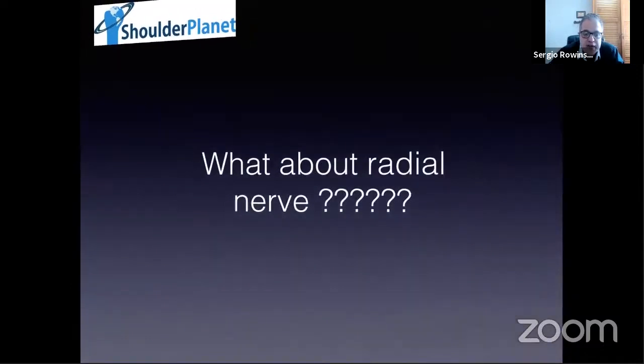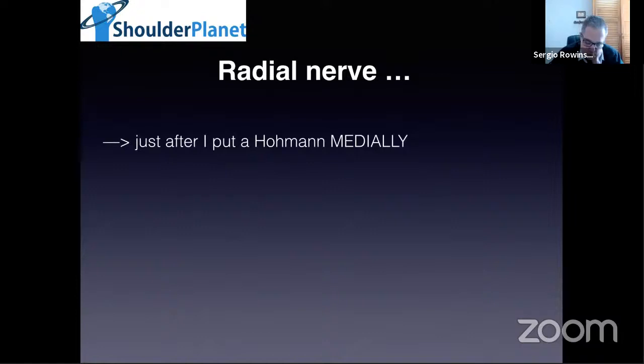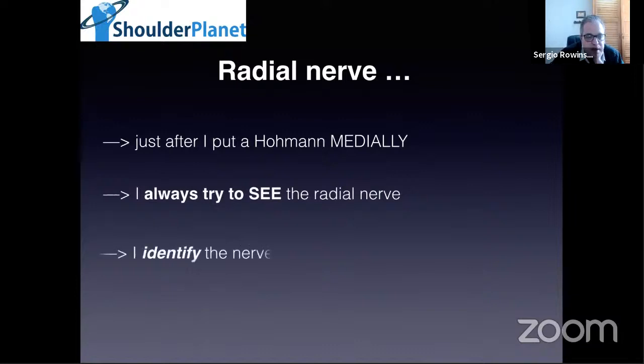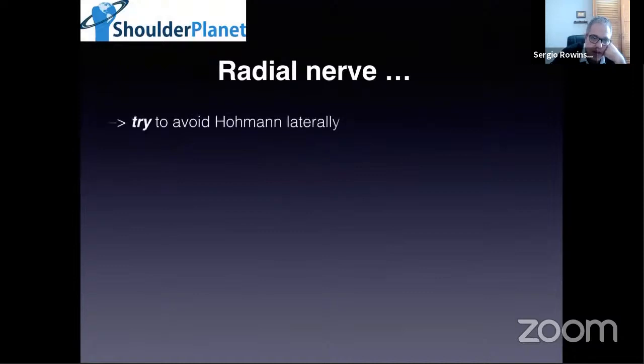About the radial nerve, after 15 years, this is my point of view. In the distal incision, I put a Hohmann medially, and I always try to see the nerve, and I find it basically in all of the cases. I identify the nerve with my eyes, but I don't tag it with a vessel loop or any other device. I just see it. I try to avoid a lateral Hohmann.